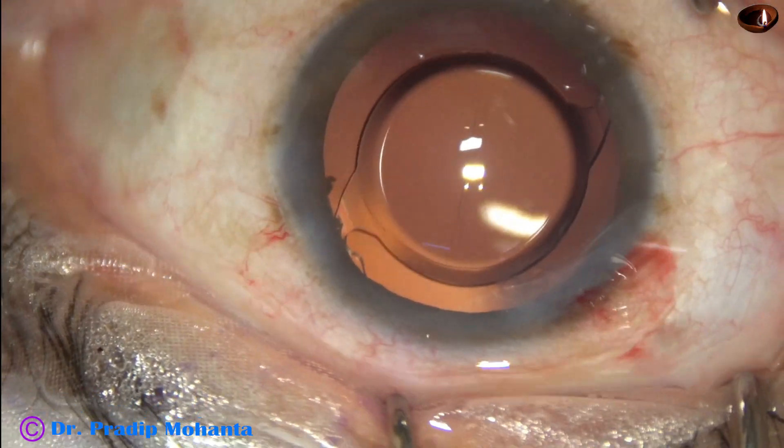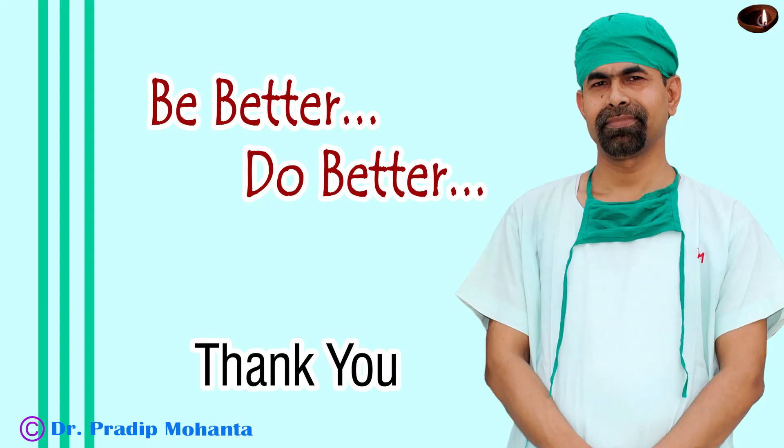A few drops of Moxifloxacin are applied over the cornea and the case is concluded. Thank you very much for your attention. Hope this video will help you in developing your surgical skills. Be a great surgeon and serve your patients with love, respect, empathy, and great surgical competence.